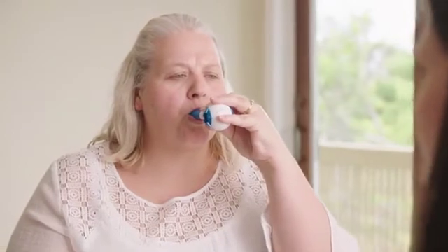Let's try again — see if you can do five breaths in a row. How did that feel? Good. Do you feel out of breath? No, good. If you ever do feel out of breath during respiratory muscle training, I want you to stop and take a break.